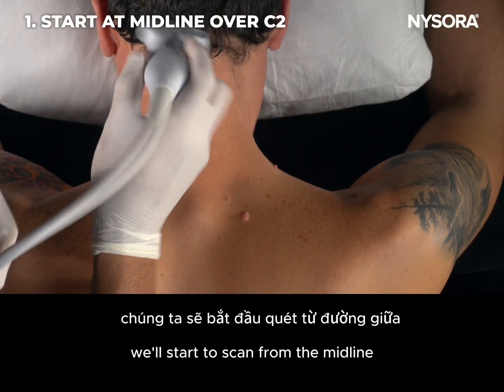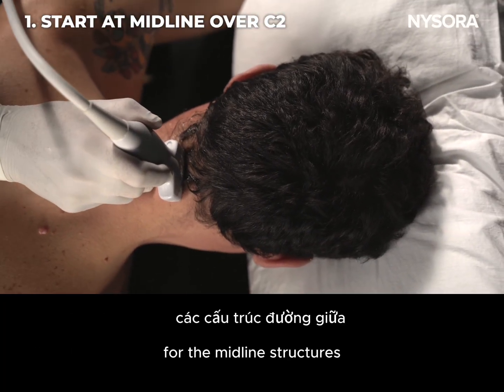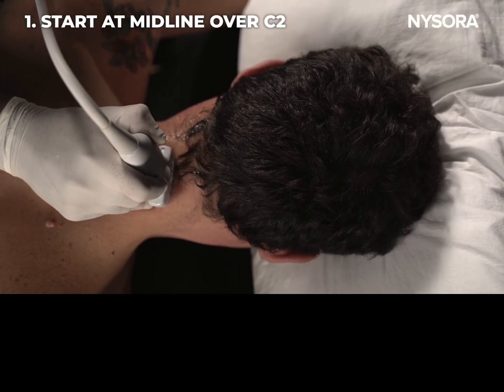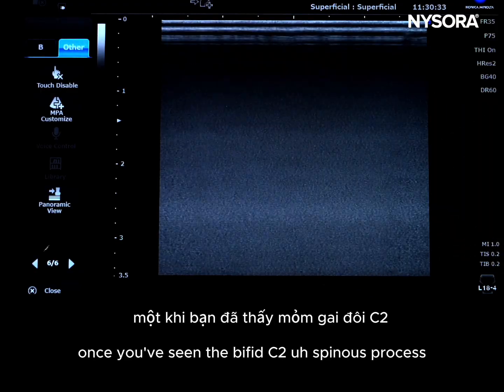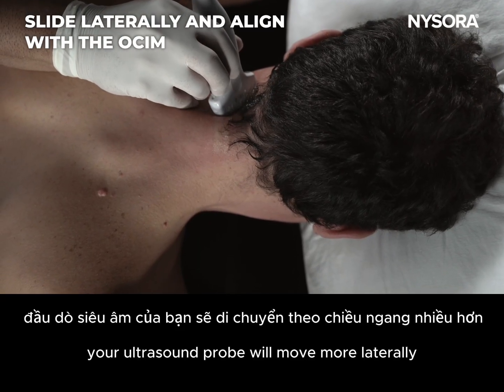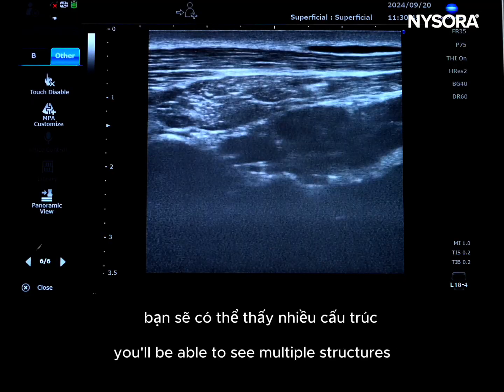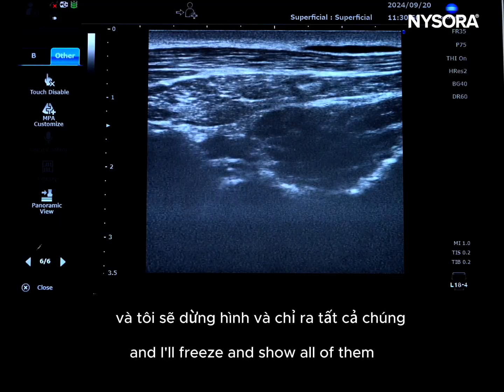We'll start to scan from the midline with technique 1, where you'll be able to look for the midline structures, and you would see here this is the posterior part of the occiput, and I'm moving my ultrasound probe more caudad, looking for the bifid C2. Once you've seen the bifid C2 spinous process, your ultrasound probe will move more laterally and aim towards the mastoid process, and in this image you'll be able to see multiple structures, and I'll freeze and show all of them.